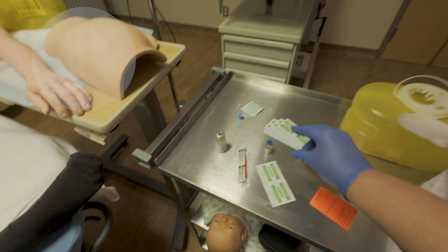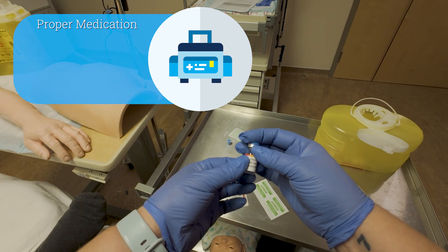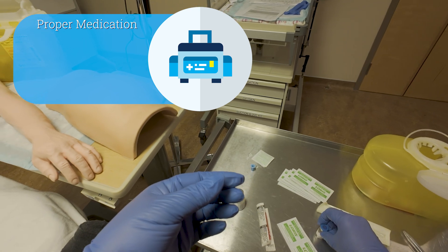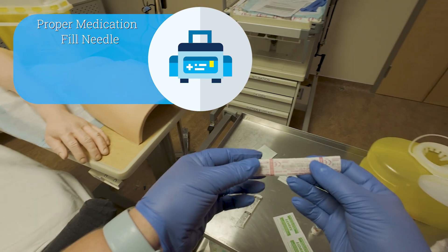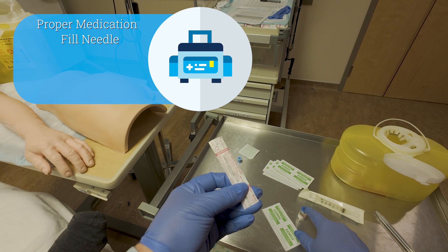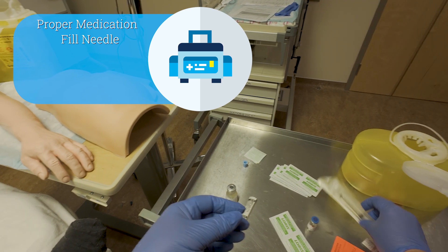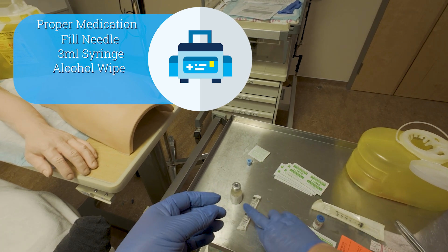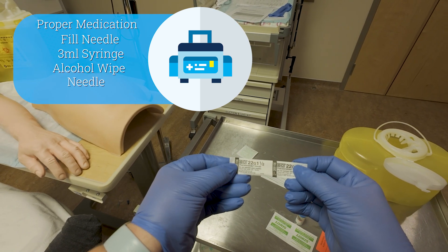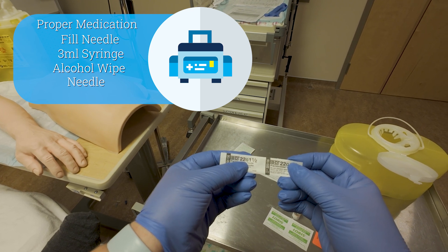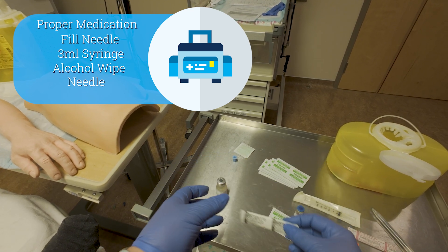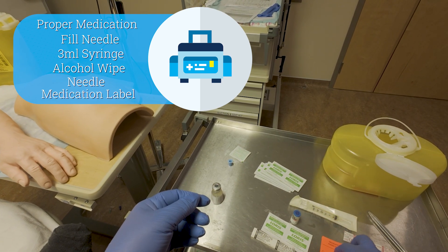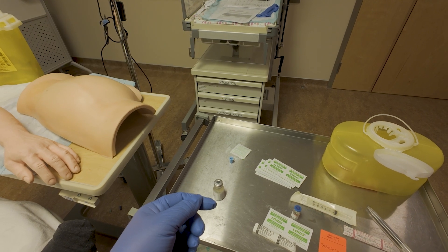Today we're going to do oxytocin, so we're going to make sure we have the proper medication and all of our supplies. We have 10 international units of oxytocin for active management of the third stage. We have a fill needle to draw our medication out of the vial, a three-mil syringe, an alcohol wipe to prepare the skin, and a needle appropriate for an adult — the 22 gauge, one and a half inch.